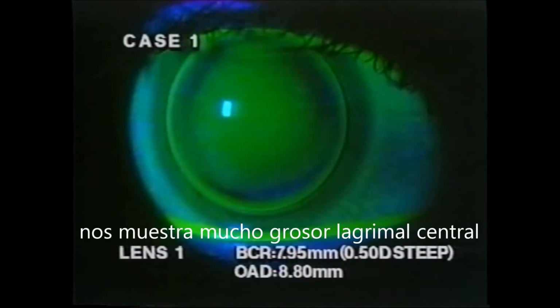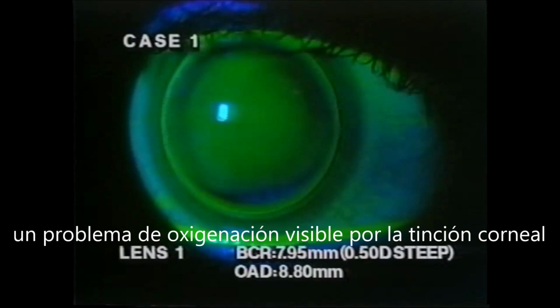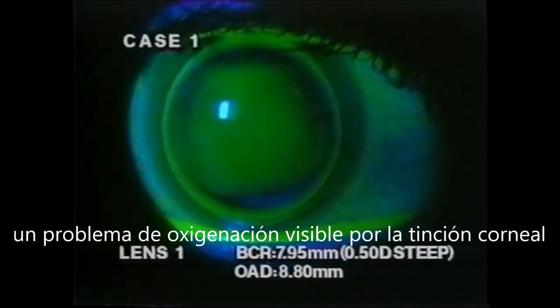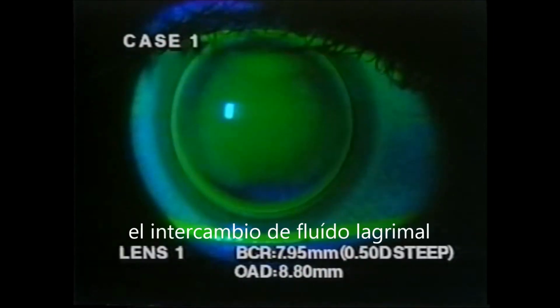Fluorescein evaluation reveals central clearance or pooling with 360 degrees of mid-peripheral bearing. This bearing or seal-off could result in trapped debris under the lens along with secondary corneal staining. Excessive edge lift is noticeable from the dense band of peripheral fluorescein.